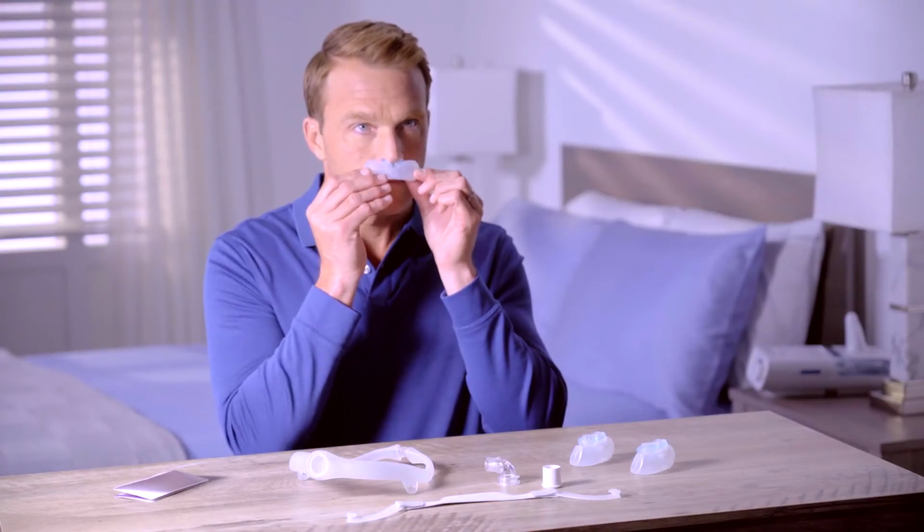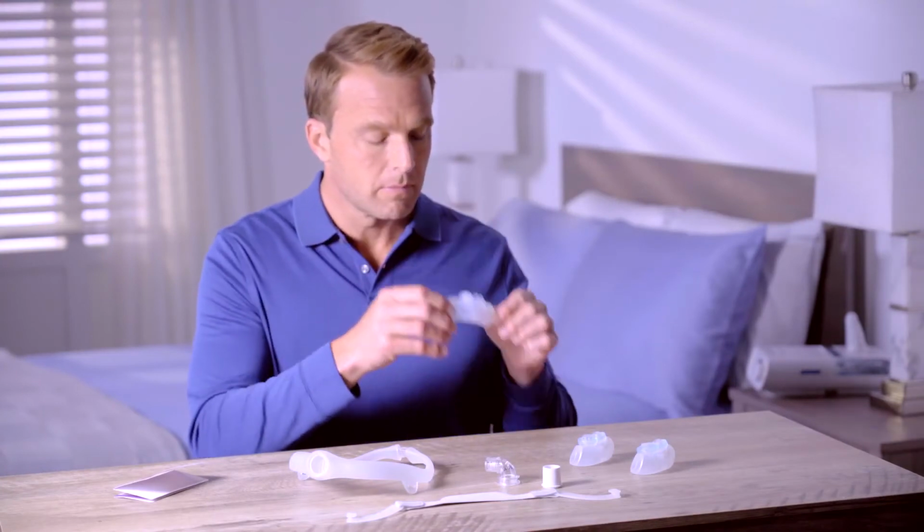DreamWear gel pillows cushions come in small, medium, and large. Try them on for size by placing the soft silicone tips into your nostrils. You want the blue gel base to sit comfortably under, not inside, your nose without any gaps.